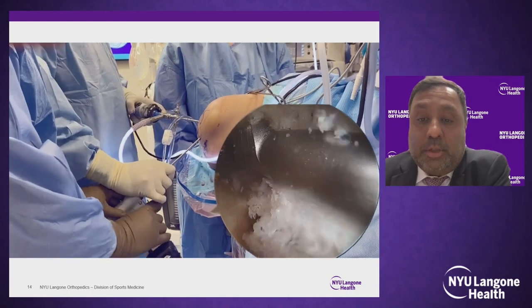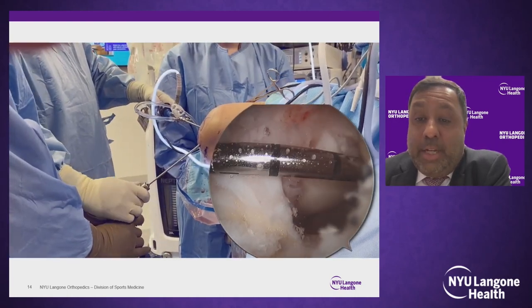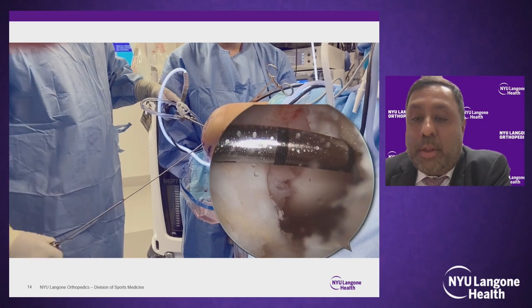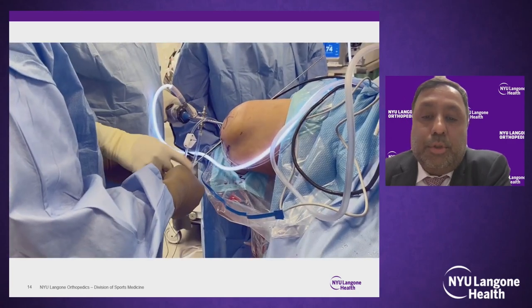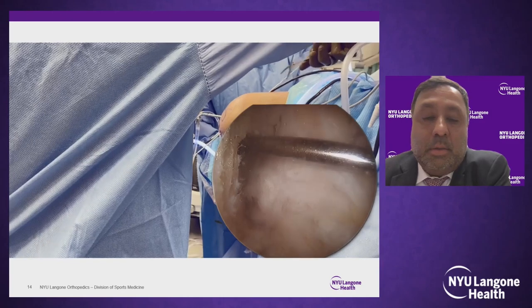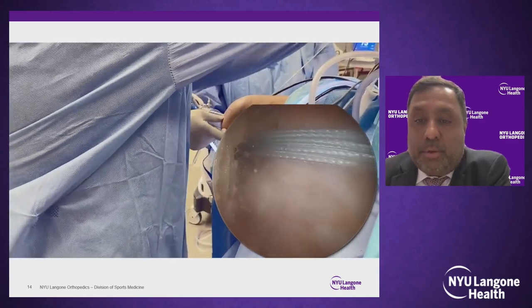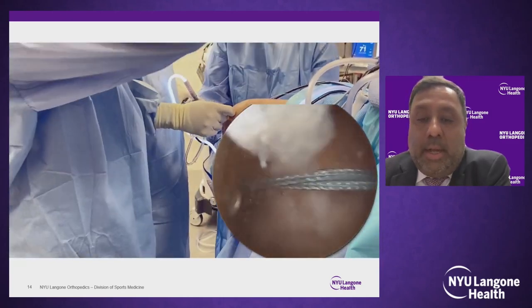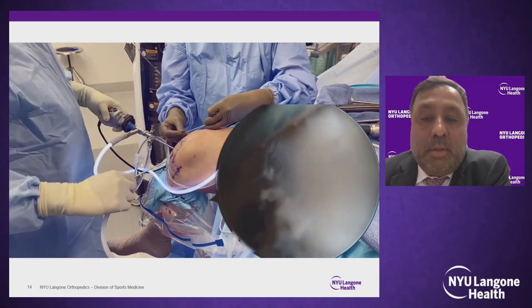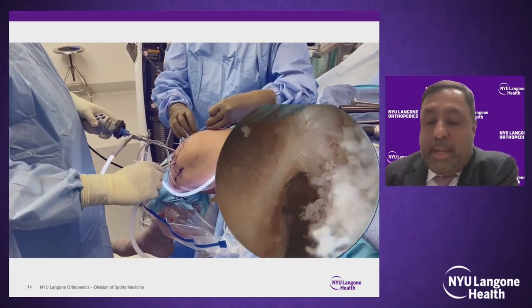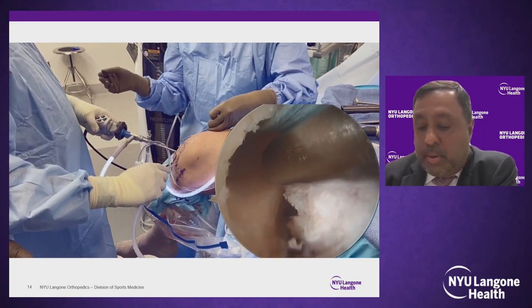I like to use this suction device — it really improves visualization. You have to take care when withdrawing the reamer. Sutures are then shuttled into the knee for eventual graft passage. The knee is returned to 90 degrees of flexion and the back wall is checked, and you can see a great femoral tunnel was created.